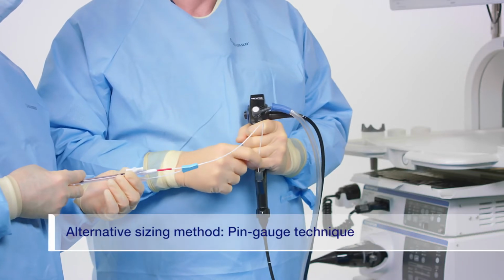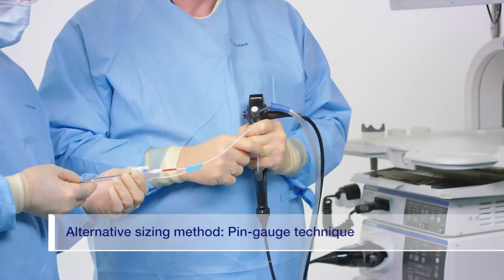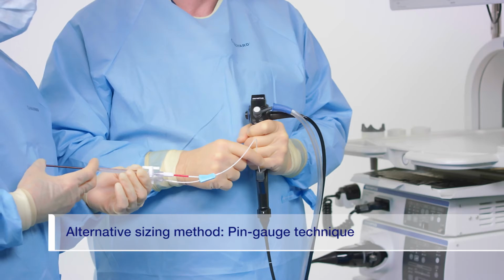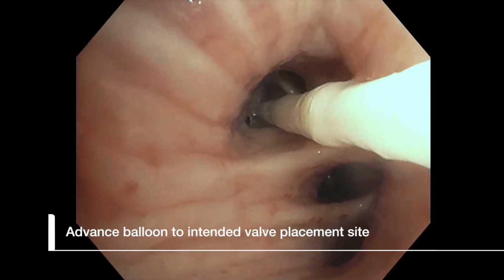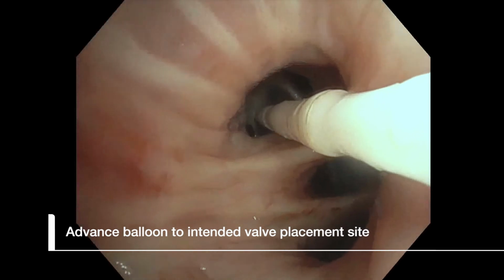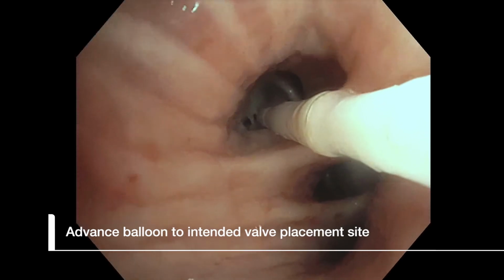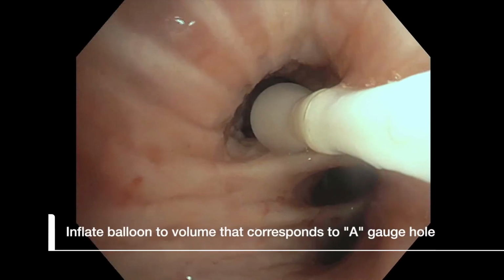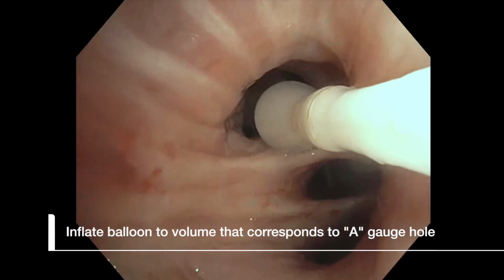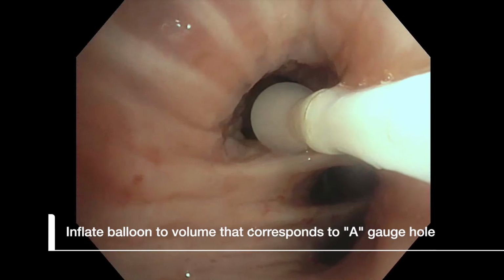An alternative method of airway sizing, referred to as the pin gauge technique, can be used. To utilize this technique, advance the balloon into the target airway, aligning the middle or waist of the balloon with the intended valve placement site.